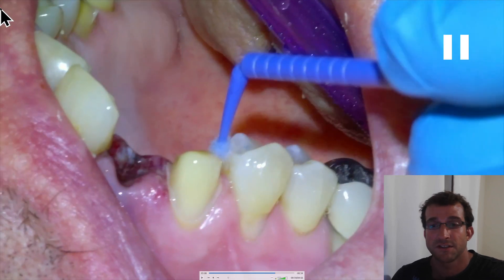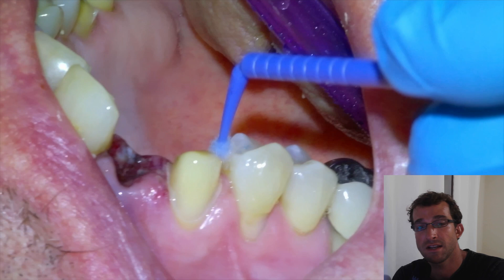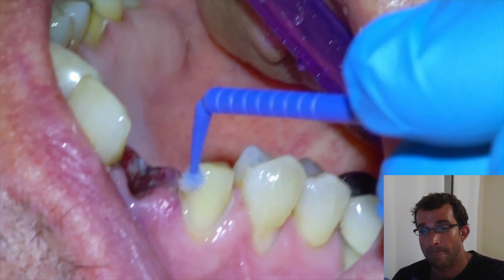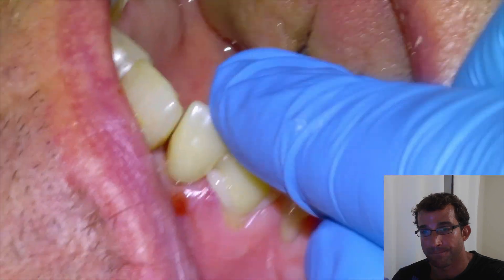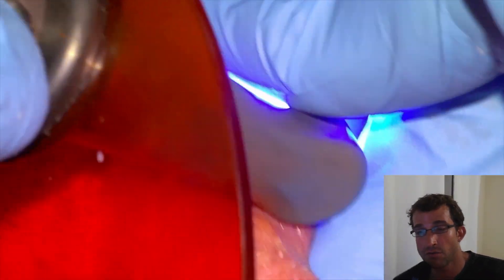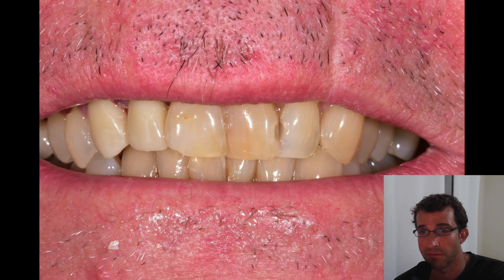The extraction socket is going to remodel and shrink down a little bit, which we'll tell the patient. Most of the time we'll say that after three months we can remake the unit so that it doesn't have a gap under it, which often forms as the extraction socket heals. But oftentimes they say that's not a big deal, so it's just an option we give anyway. We'll prime the tooth, load up the unit with resin cement, seat it down, cure it, clean it up, and it's ready to go. There's the immediately post-op result, and there's a before and after — that's going to work just fine.